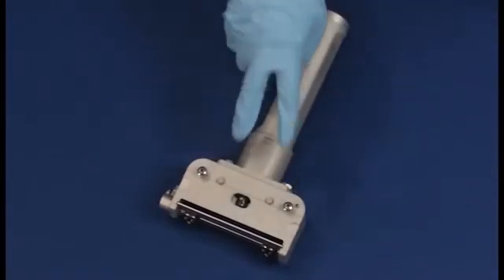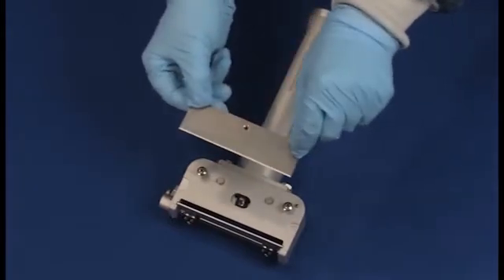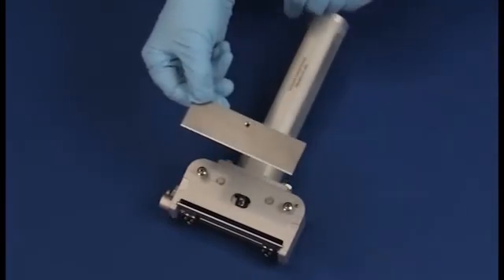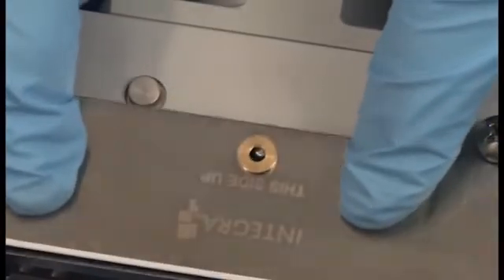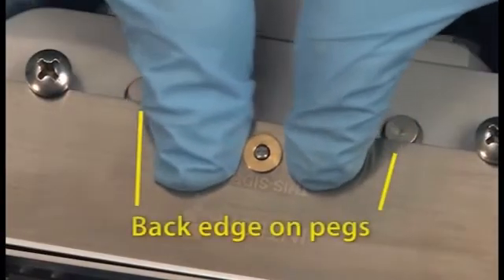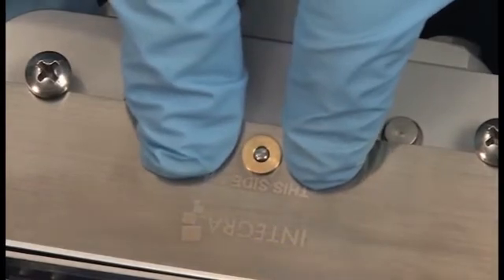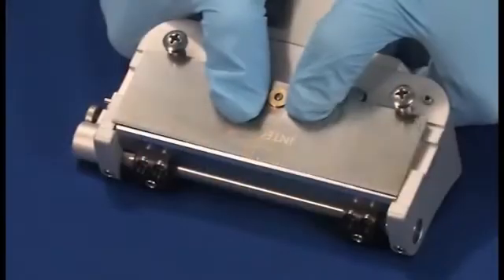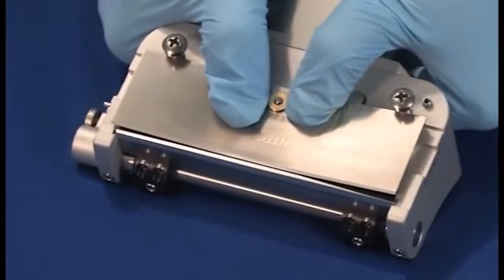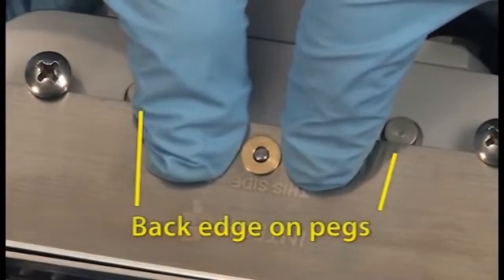Note that the dermatome has two pegs for holding the blade in place. Prior to placement, the blade should be given a very thin coat of sterile mineral oil on the unmarked underside. With the Integra logo up, center the blade hole over the oscillating pin with the back portion of the blade resting on the two pegs. You should be able to press down with your thumbs on either side of the blade and observe the oscillating pin passing through the blade hole as the blade bends slightly. Note that while doing this, the back portion of the blade continues to rest on the pegs. This is the starting position for installing the blade.